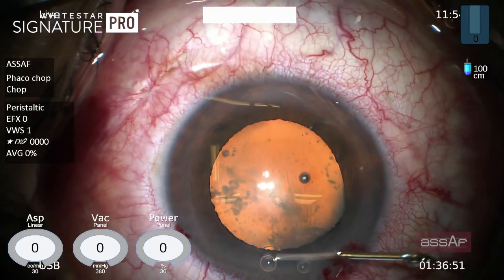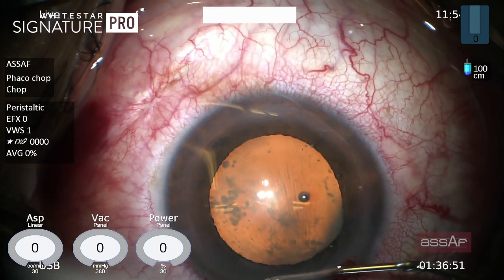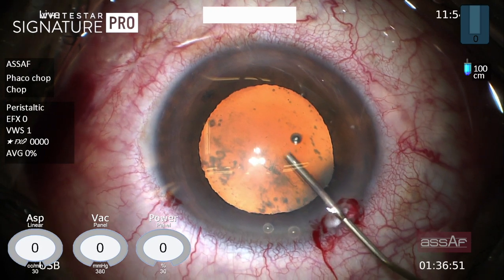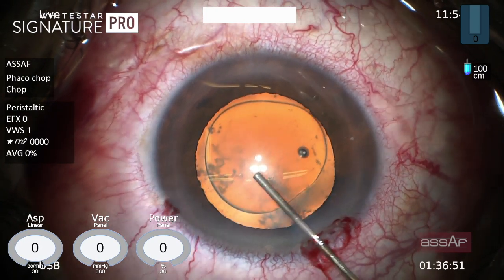Now removing some of those air bubbles by aspiration before proceeding to the next step, which is injection of cohesive OVD for the soft shell technique.